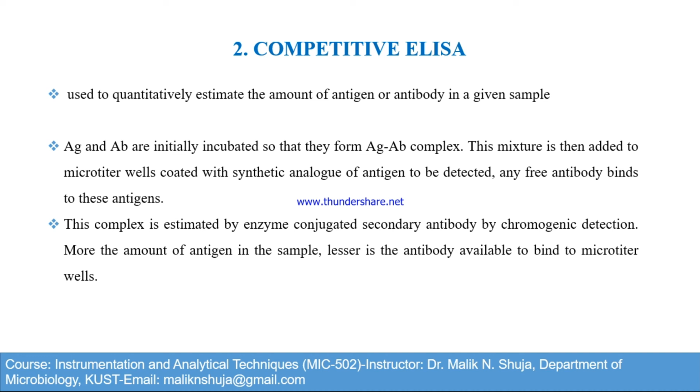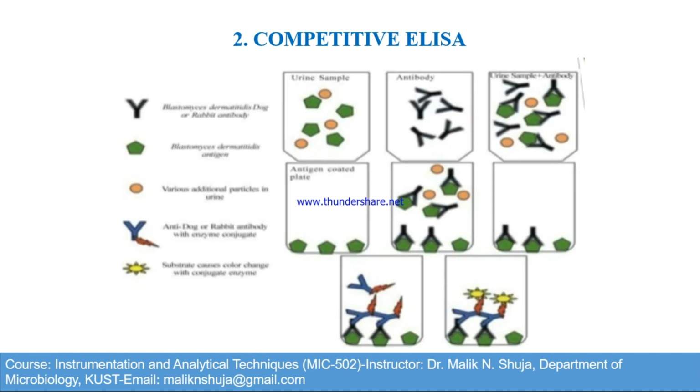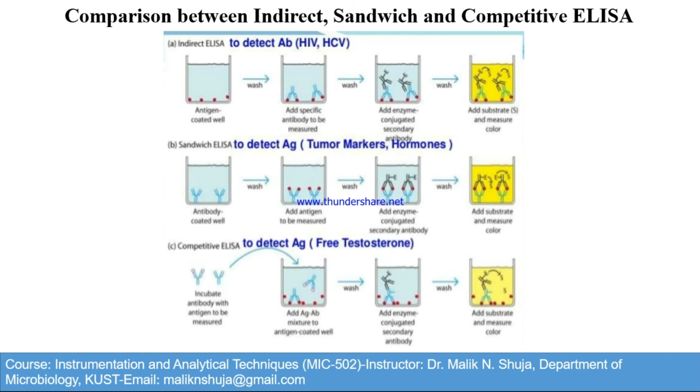Competitive ELISA I have already explained in detail, which can be used to find out the concentration of antigen or concentration of antibody in a given sample. This slide indicates the comparison of indirect ELISA, sandwich and competitive ELISA. I have explained each and every type of ELISA in detail.